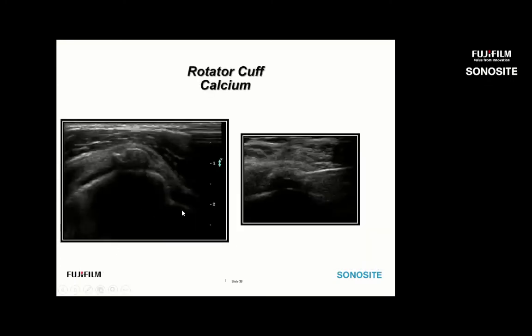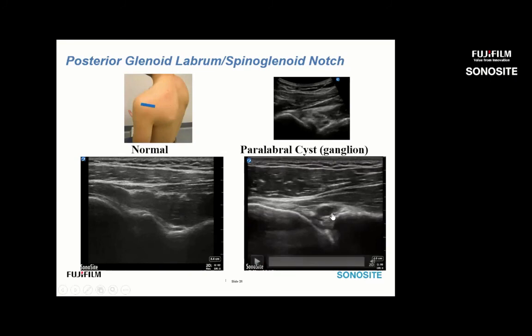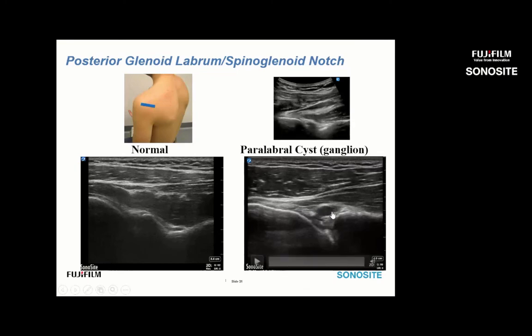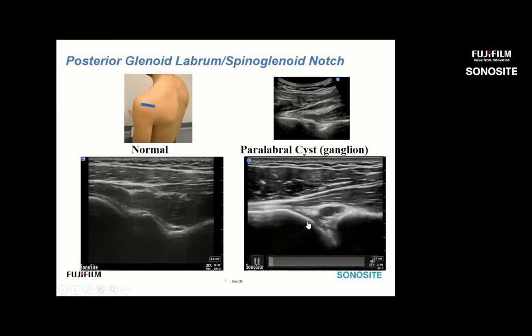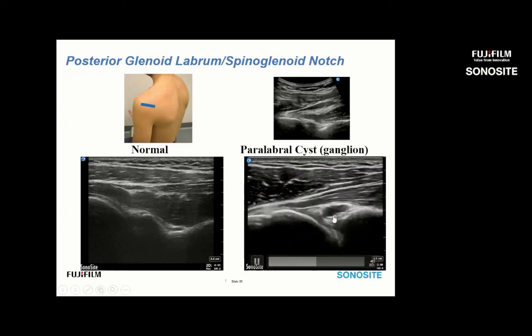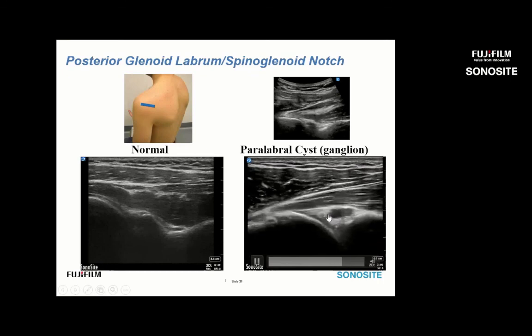The reason to scan in internal rotation is to confirm that what we're looking at is not a vein — with external rotation, a big vein will become larger and can be mistaken for a spinal glenoid notch cyst. Here's an example of a posterior labral tear with a paralabral cyst: a little bit of laxity to the labrum with an adjacent cyst.